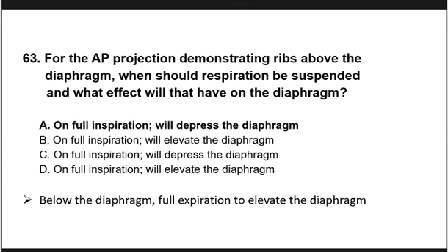So that is full inspiration, wherein pag full inspiration ang instruction, the diaphragm will be lowered or depressed. So pag above the diaphragm, inspiration ang instruction. When we instruct the patient to take a deep breath, then the diaphragm will be depressed.